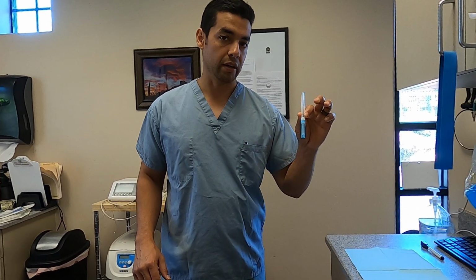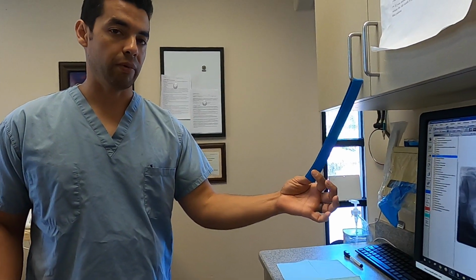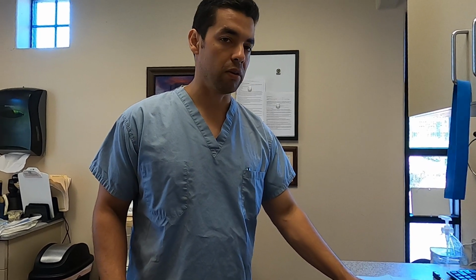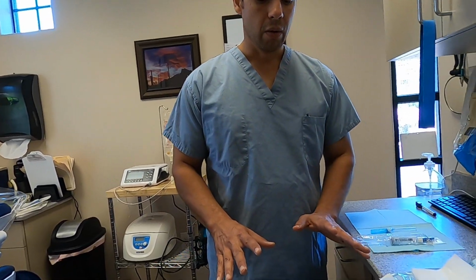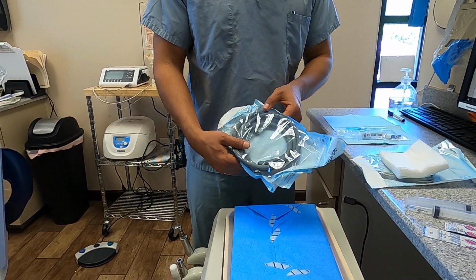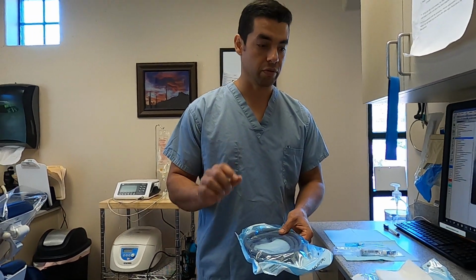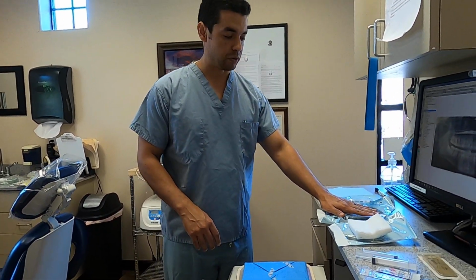We have the 22 gauge needle ready to go, and we have a tourniquet ready for IV placement. We should also have an alcohol swab ready to go so that we are ready to place when that time comes. In the basic setup here, we have a surgical aspiration hose, and it should have a surgical suction with it as well. That should be ready to roll.